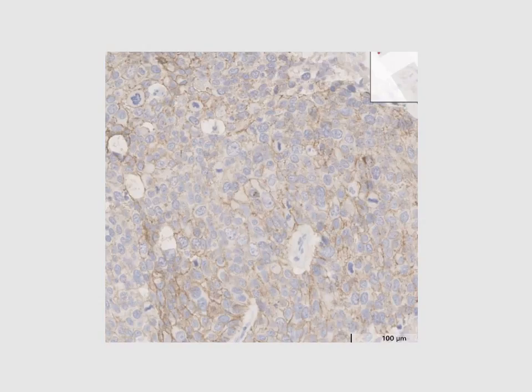If we zoom in, you will be able to see an increase in mitotic figures, and there is also evidence of necrosis, which confirms that it is a high-grade carcinoma.